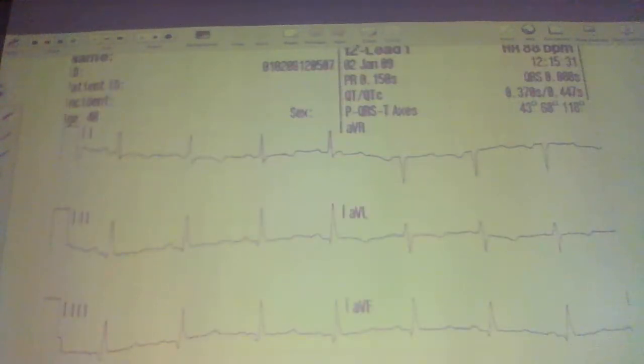All right, so let's take a look at a few examples here. So this is just kind of a half sheet of a 12 lead EKG. I've cut off the precordial leads, which often happen to the right here. V1 through V6 are not on this drawing. The only thing we've left here are the important leads for this exercise, and that is lead 1 and lead AVF. So if we want to determine what the axis is here, we're going to quickly take a look at the orientation of lead 1 and decide, is it upright or is it negatively oriented? So take a QRS complex. I think we'll all agree it is upright in this case. We're going to do the same thing for lead AVF.